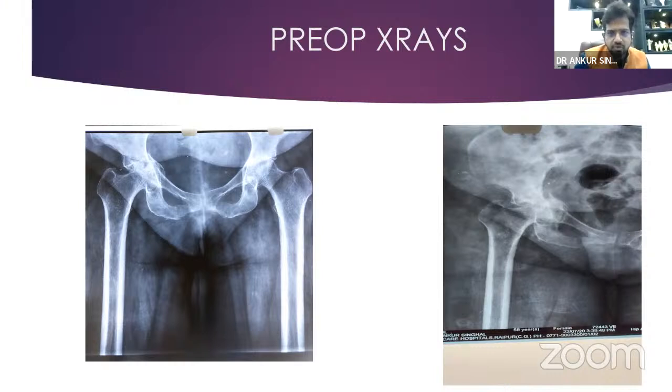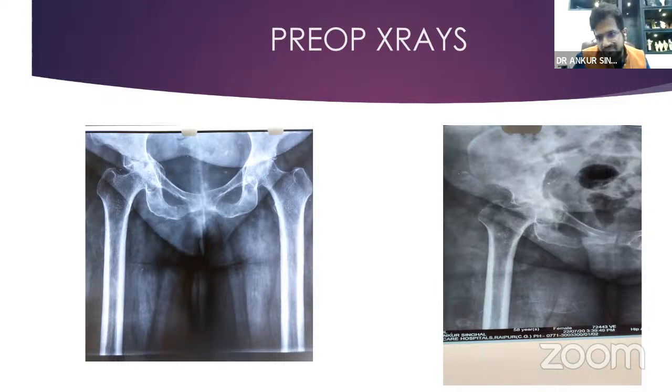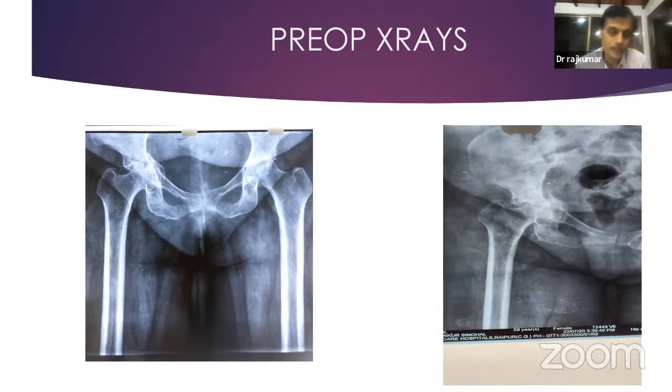So at this stage, you should not have touched the hip, right? It should not be touched, it is not indicated. An anterior column fracture alone, going ahead and doing a plating, so much of a big plate inside, not needed. So you should have waited. I will say maybe, and that's why I said it's easy to comment retrospectively. If it had not had all these problems, and if it had survived without loosening, then everybody would say, yeah, that is the right way of treating it. But putting in an anterior column plate alone in this kind of situation, I will not.